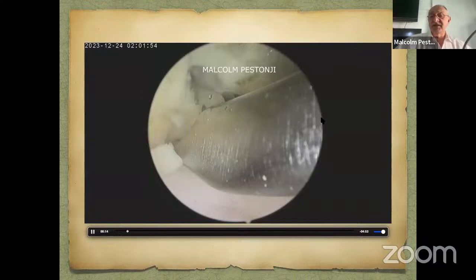I'm about to enter inside. I'm not stretching out the flavum. I'm not pushing with my scope. There's no pressure there as such. And you can see how the punctate bleeding is increasing. So safely, very safely, I've thinned out this flavum.